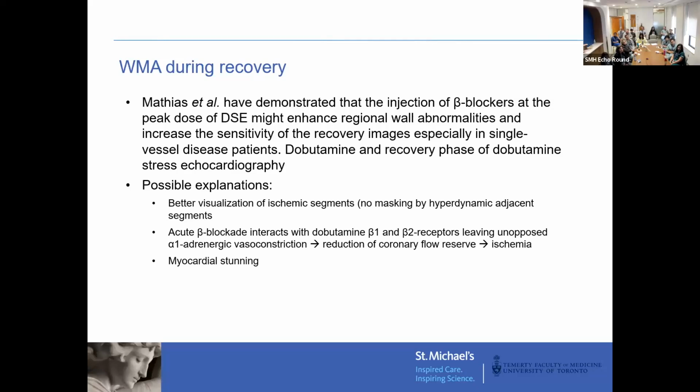And the third explanation is maybe you're now identifying stunned myocardium, and that's different from something that you would be able to identify at peak stress. So various explanations. We don't fully understand it.